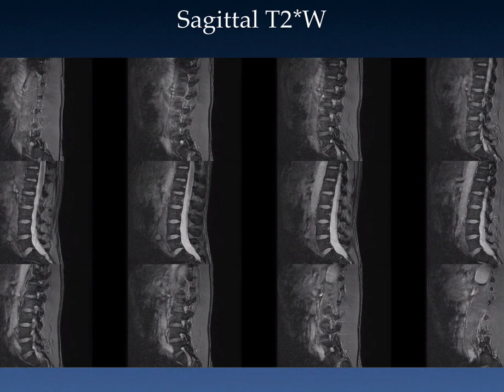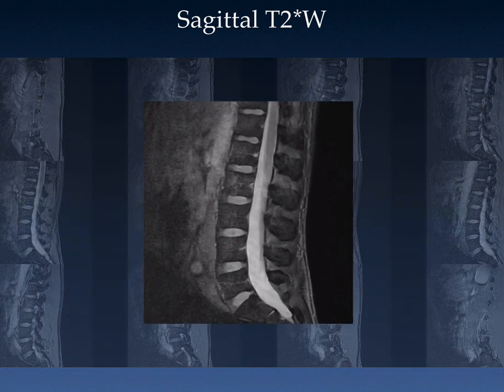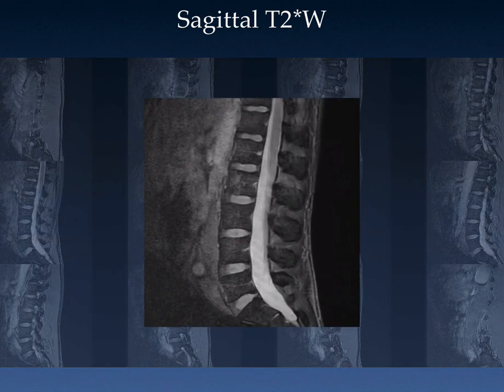Here are samples of the T2 star weighted sequences. Again, covering side-to-side quite well, with good contrast out in the nerve roots and foramina, and good contrast between the cord and CSF. You can see the nerve roots quite well, the intervertebral disc, and the interface between the disc and the CSF is very nicely shown. There is also pretty decent contrast within the individual intervertebral discs.